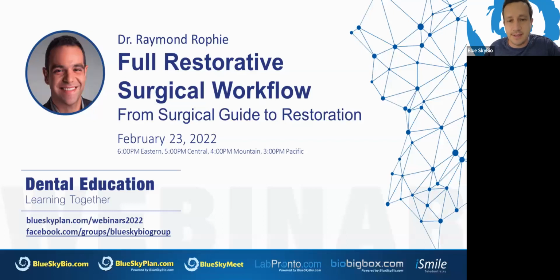Today, he will be presenting on the topic of full restorative surgical workflow from surgical guide to restoration. And as a final comment, I'd like to point out that exports from the crown and bridge module, both to STL files and to the XML milling data, is completely free of charge.